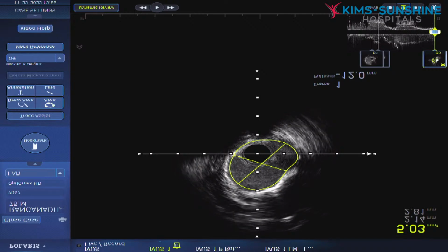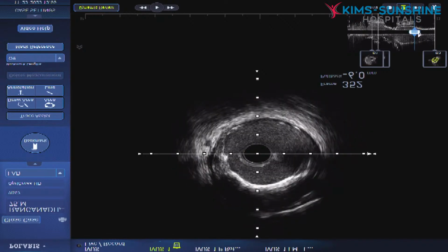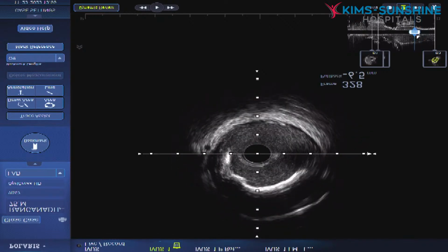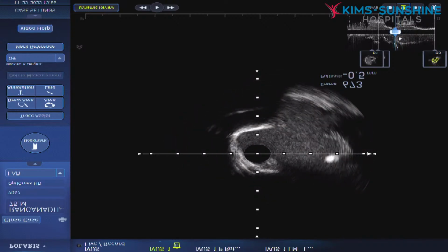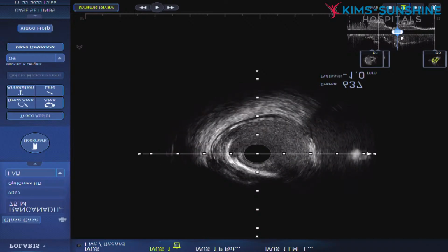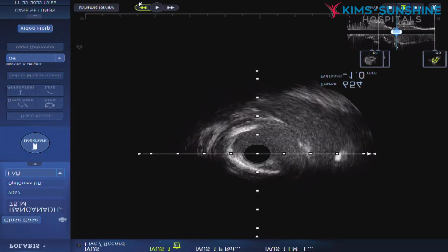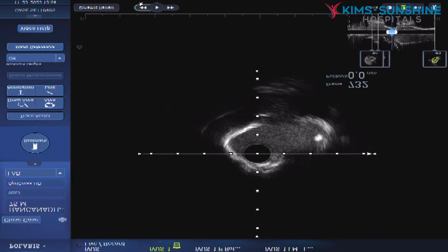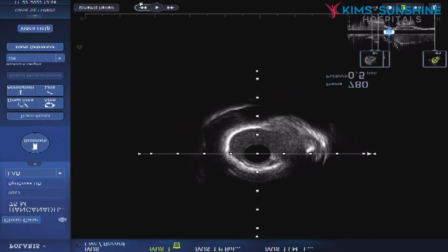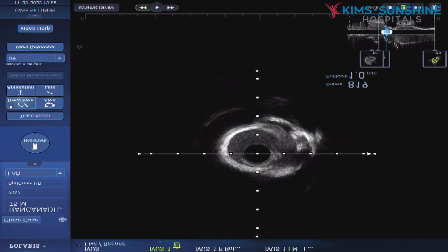Though calcium is there, plaque burden is there, come this side only toward the left main. Wait. Okay, slightly one back. That is LCX. Slightly move back. Move back this side towards the left main. That is LCX appearing. No. Slightly. Still. That is LAD area. That LAD area, slightly move back one frame. Now you take that area.